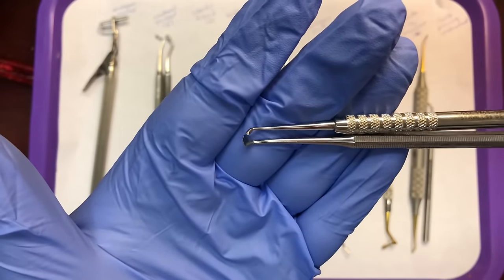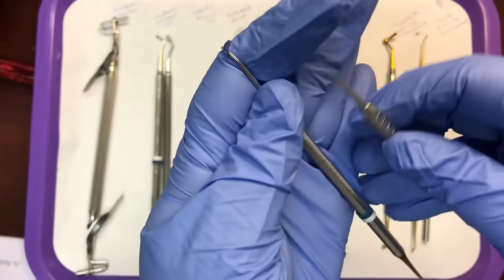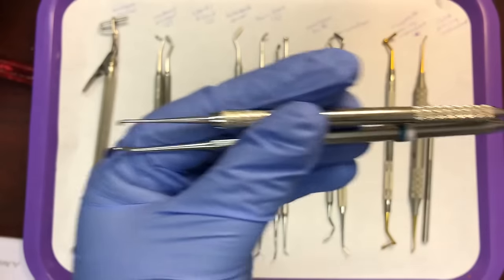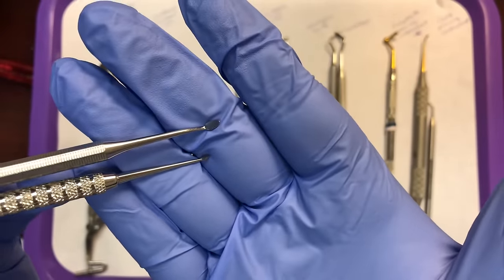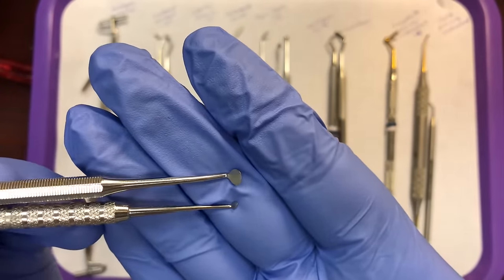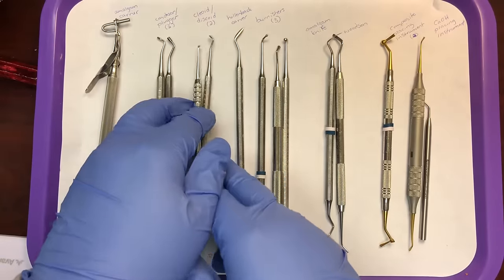Next are cleoid discoid carvers. Cleoid discoid carvers carve the occlusal surface of the amalgam. The discoid end is the rounded end, and the cleoid end is the pointed end — think of it as a claw shape for cleoid and a disc shape for discoid. They come in different sizes; some are technically called Tanner carvers, but we'll just memorize them as cleoid discoid.